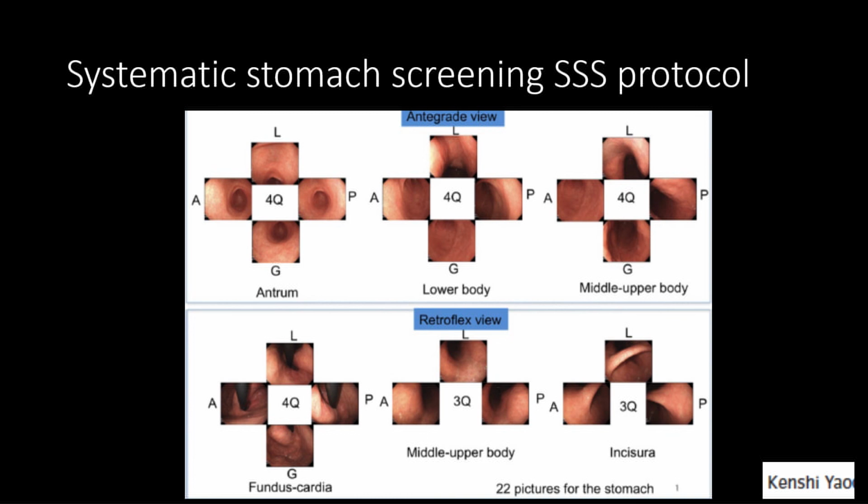And typically when you do the procedure, when you do NBI, you've got to the antrum, now you're looking at the pylorus, you freeze. Then you say, okay, now I have a picture like this. You look at one quadrant, this quadrant, this quadrant, this quadrant. Look at all four quadrants and ask, do they all look all right? Do they look the same? That's how you look at it. Once you get trained, it's very quick. In fact, once you have some experience, even when your younger colleague is putting the scope in, you say, I saw some lesion here. That's how you train your eyes. So this is how you document for the stomach.